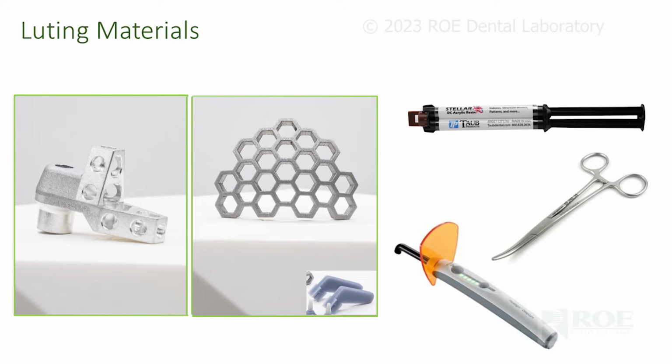And then really you just need the OptiSplint kit. You need some material to lute, which you can use composite, but composite's a little brittle and it can come apart if it's not used perfectly. So we really like this stellar material. It's basically a non-shrink acrylic. You should have just a pair of forceps just for delivering this to the mouth, the frame.